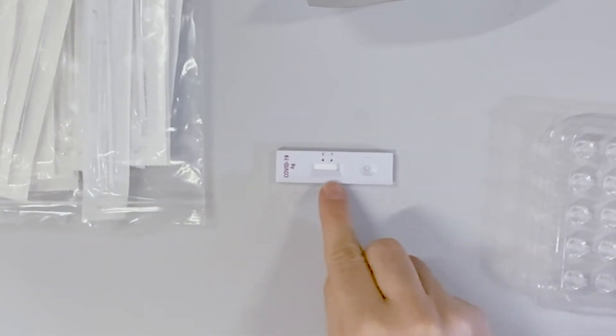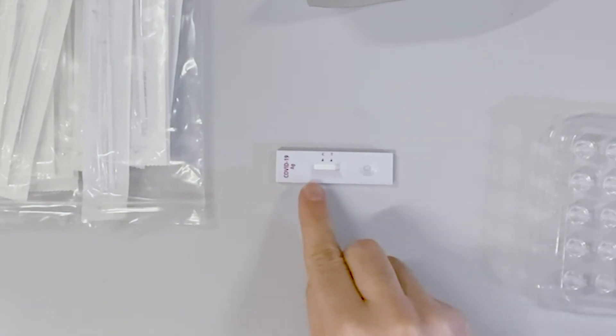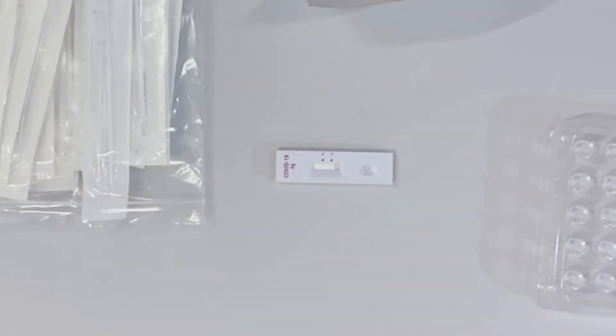The result is read very similar to a pregnancy test. A line at the top section shows the test is working, and a line in the bottom section shows that the person tested positive for COVID-19.